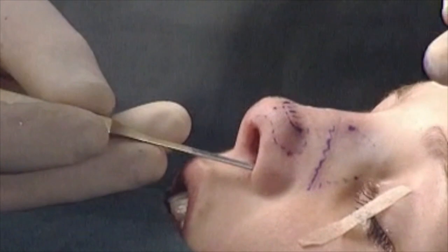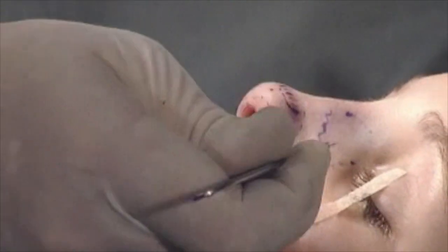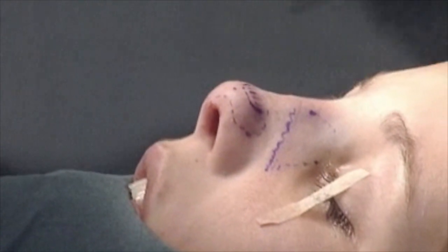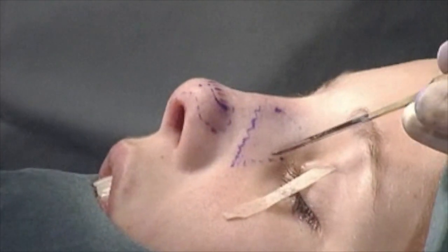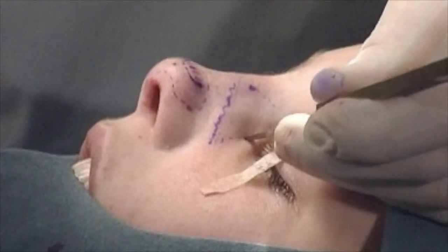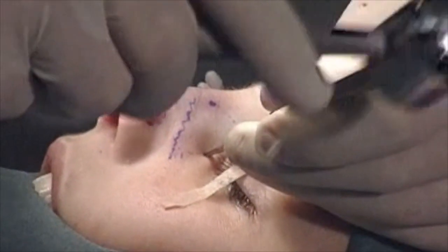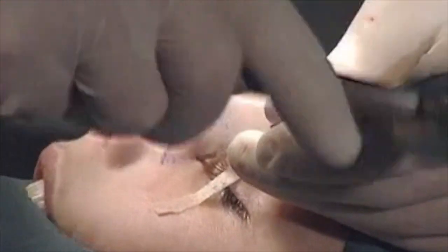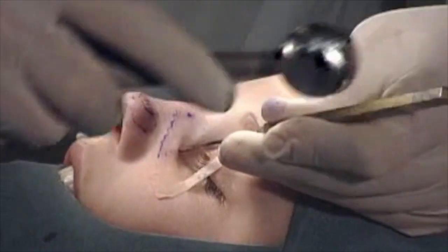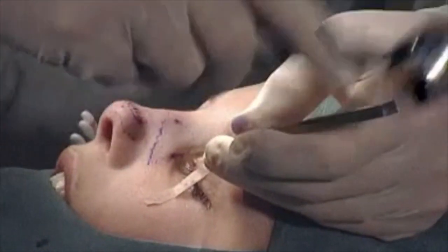So I show you at the left side the percutaneous osteotomy. We make first an incision, halfway the pathway, as you can see here. Be aware of the angular artery. It can be annoying, the bleeding. So what I often do is to bring my osteotome a little bit up, scrape it down, and then start my little point osteotomies. Okay, that's one. Go downward. Leave a little triangle of bone at the piriform aperture.